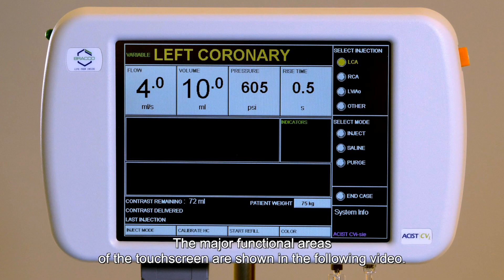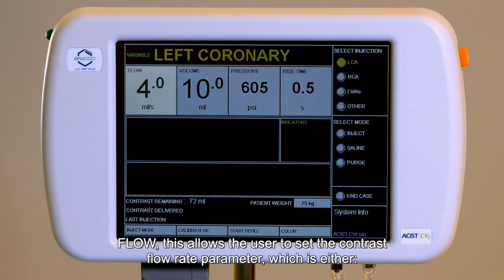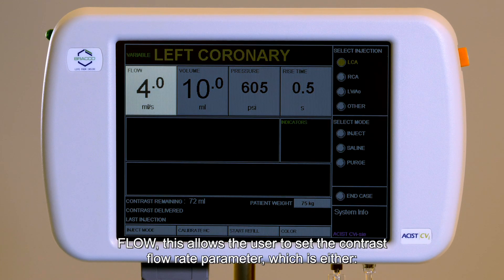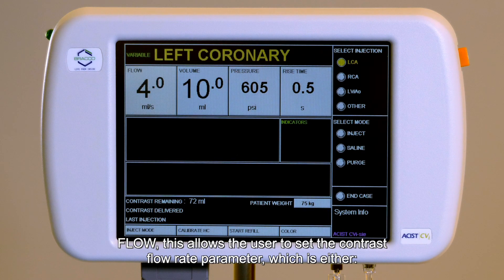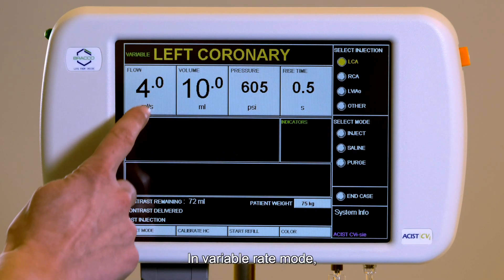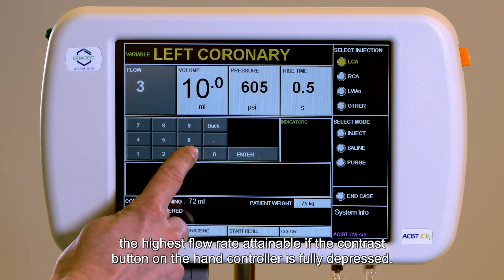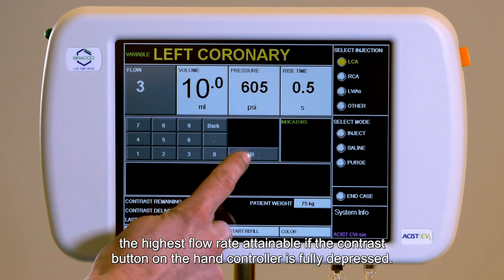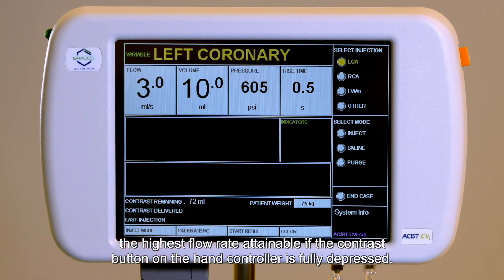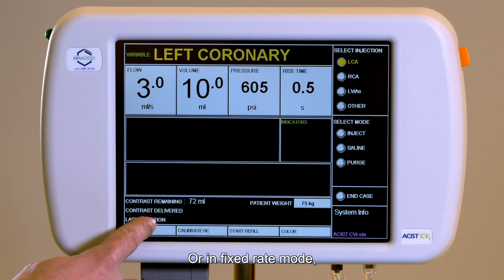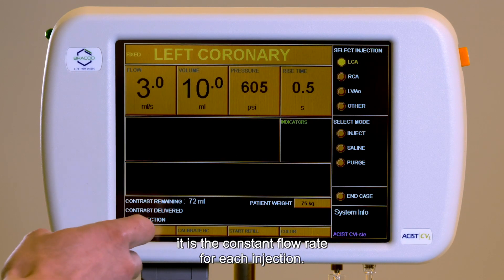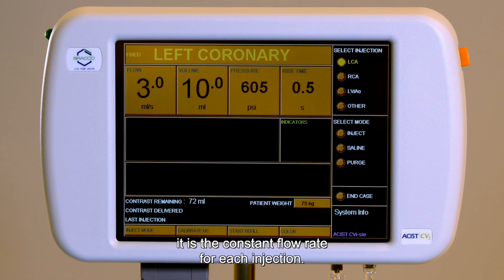The major functional areas of the touchscreen are shown in the following video. Flow: this allows the user to set the contrast flow rate parameter, which is either in variable rates mode the highest flow rate attainable if the contrast button on the hand control is fully depressed, or in fixed rates mode it is the constant flow rate for each injection.